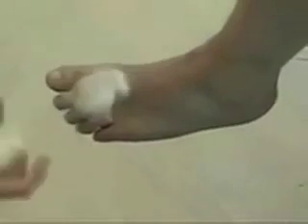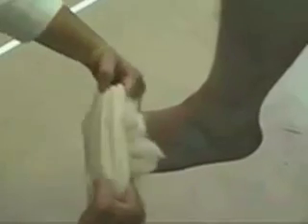We are going to use lamb's wool in between the toes. Following that, we'll apply a three-inch stockinette to the foot. This stockinette is typically applied to a level of three finger breadths below the fibular head, which is marked with an indelible pen.